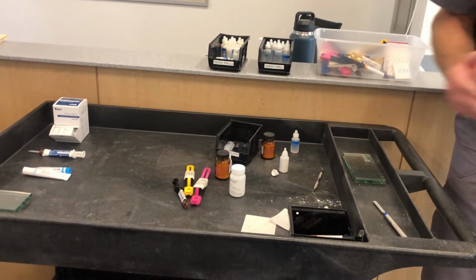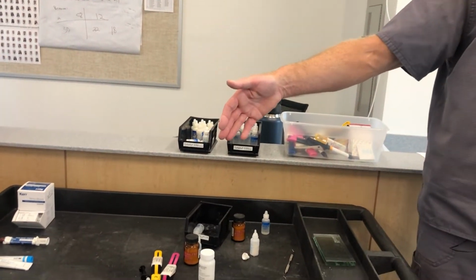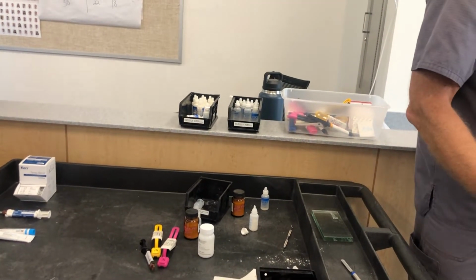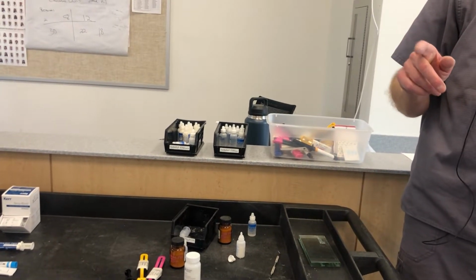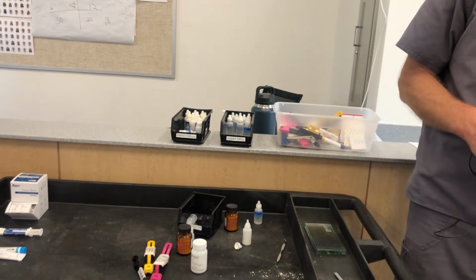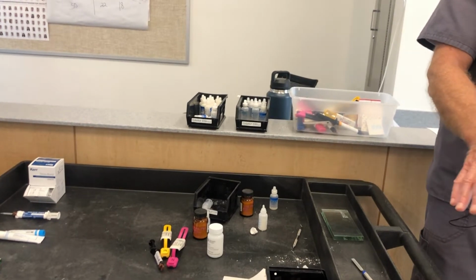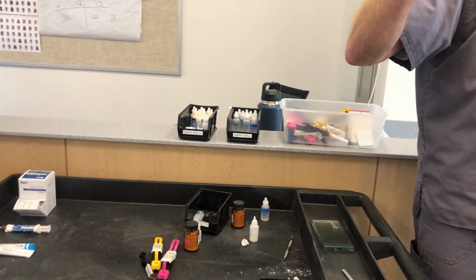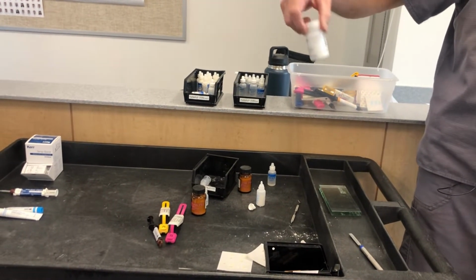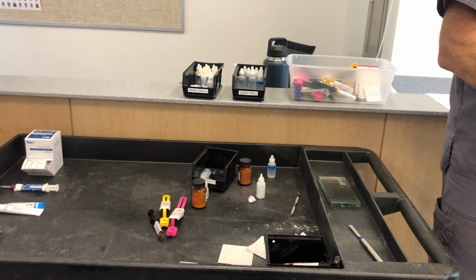IRM is another material that you want to use on a glass slab. So, intermediate restorative material, IRM, it was actually developed, I think, by the military. And they had a color coding system. If out there in the boonies a temporary filling was put in, they had a red version of this that meant there was a pulp exposure and it needed endo. So once they got back to where they had access to good dental care, that red IRM was a signal to the dentist, well, this is gonna need a root canal before we do anything.